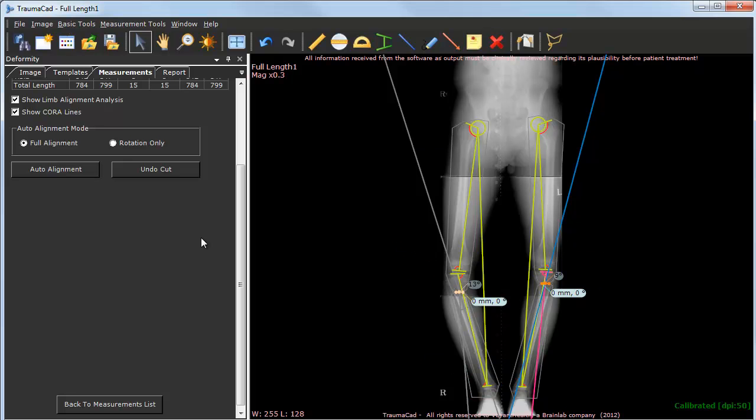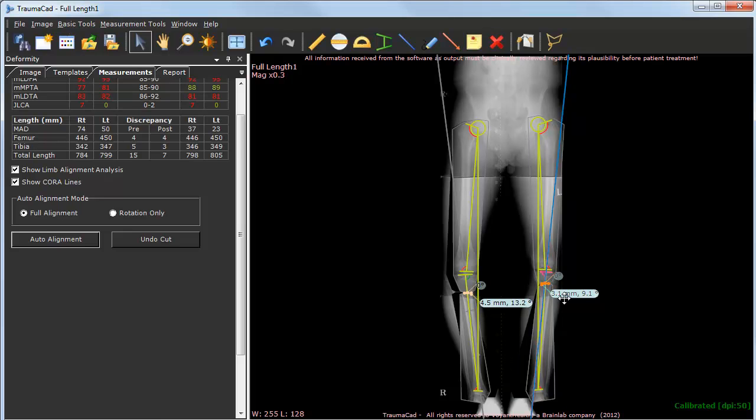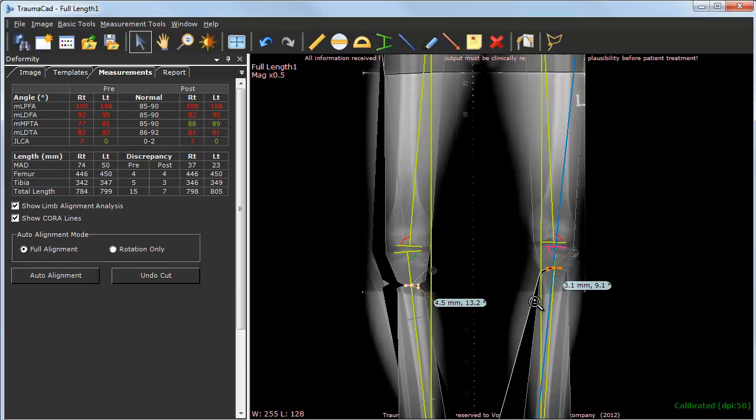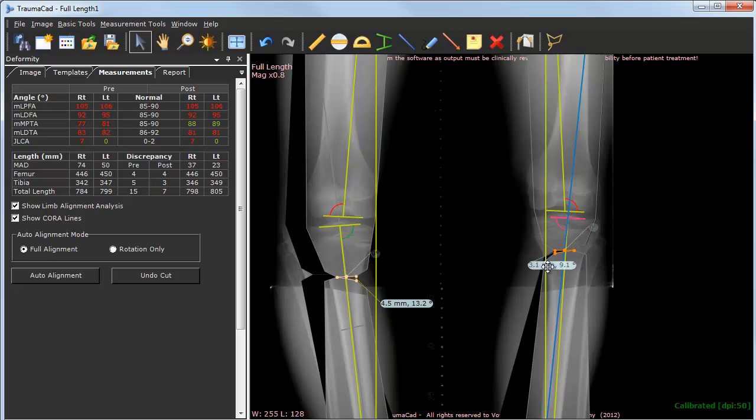Finally, click the Auto Alignment button to align the limbs. Now you can view the osteotomy parameters, including wedge angle and distance.